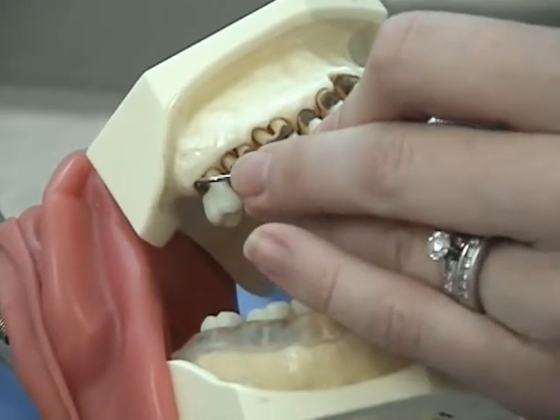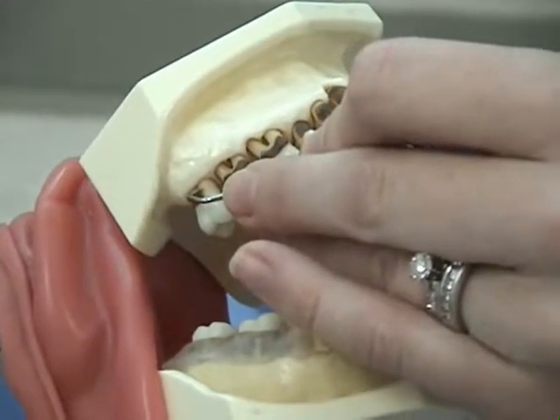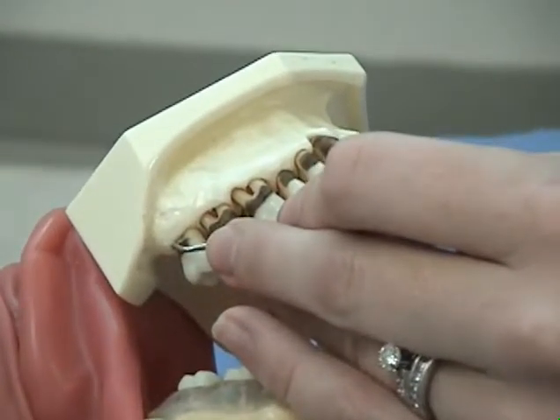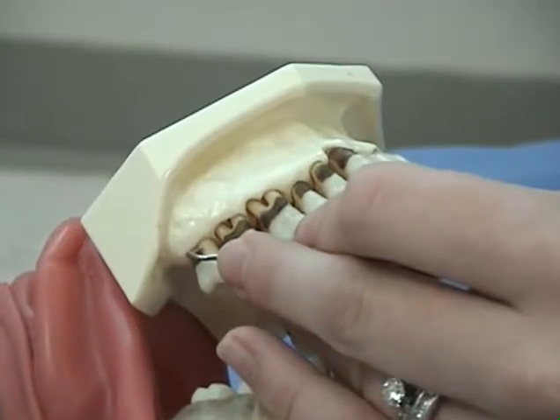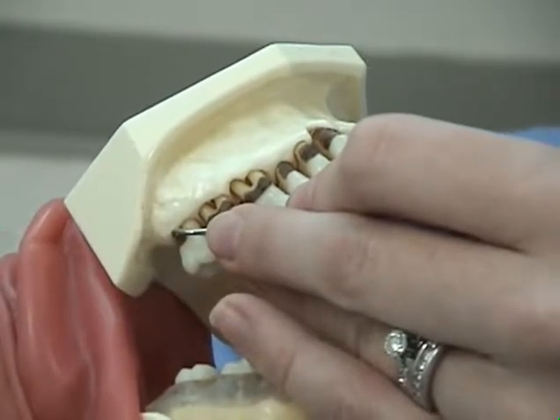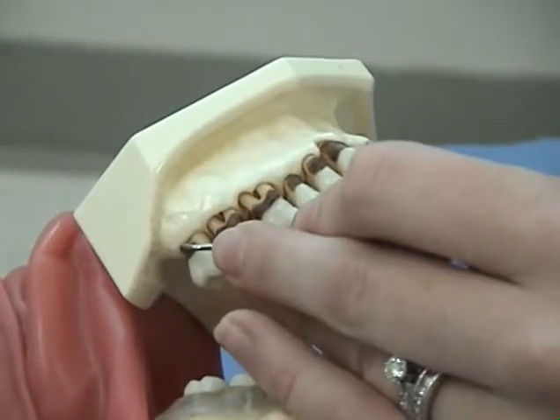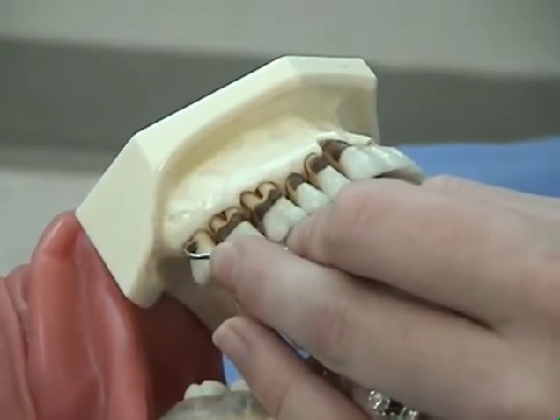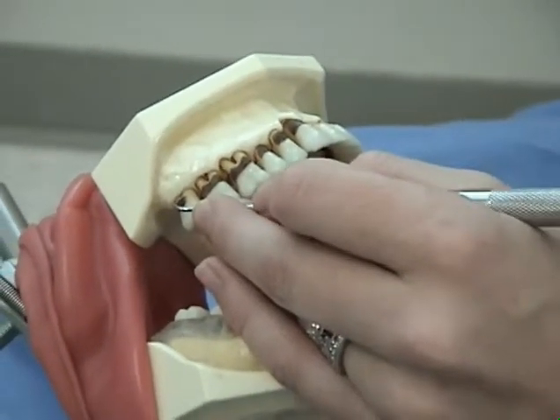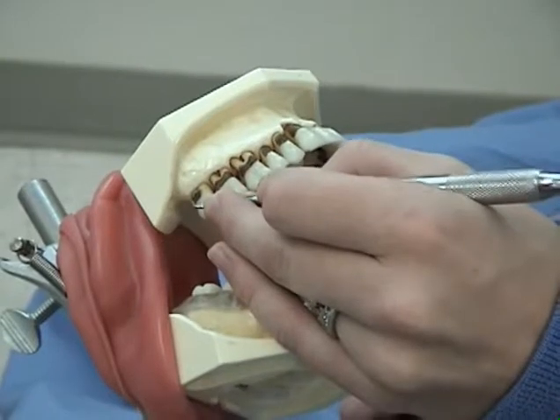Insert the working end beneath the gingival margin with the toe tipped toward the gingival margin and the face of the curette in a closed position. Adapt the cutting edge to the mesial of the distal facial line angle. The toe should aim toward the back of the mouth. Open the face and check that the terminal shank is parallel to the long axis of the tooth. With a wrist rocking motion, work at least halfway across the distal surface from the facial aspect, keeping your cutting edge adapted to the tooth at all times.